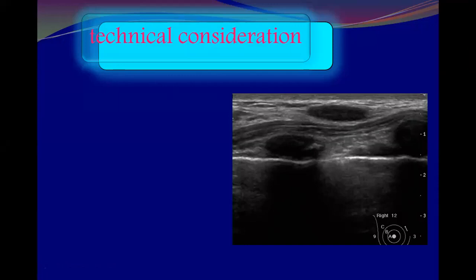This is part of the cage of the... Representing what? Yes, you are right, the junction of the... These are pseudo lesions. Yes, these are costal cartilage, the costochondral junction, or rib shadow. And why?